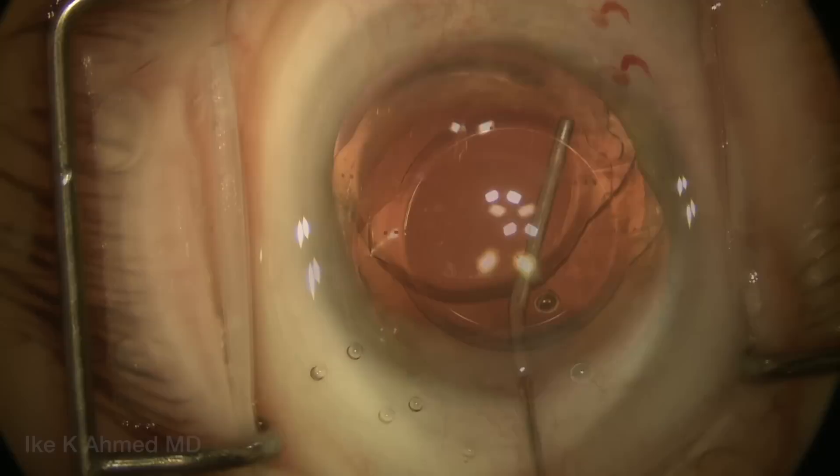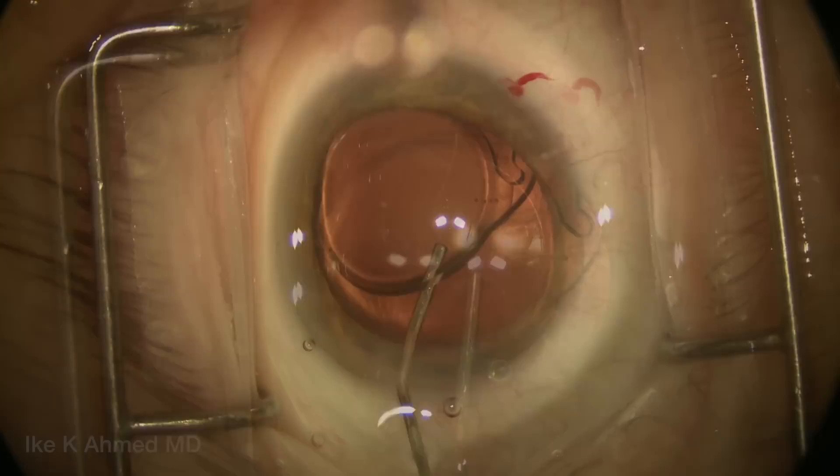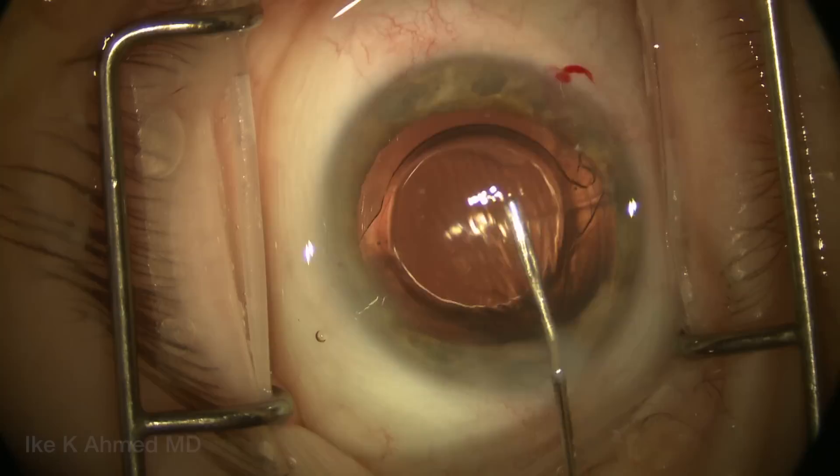Here we're injecting some BSS under the capsule to ensure all the OVD has been removed from behind and around the IOL. We can see the capsule come up, showing the OVD has been removed. Keep in mind that viscoelastic is still retained in the anterior chamber to prevent AC shallowing while it's been removed behind the IOL.